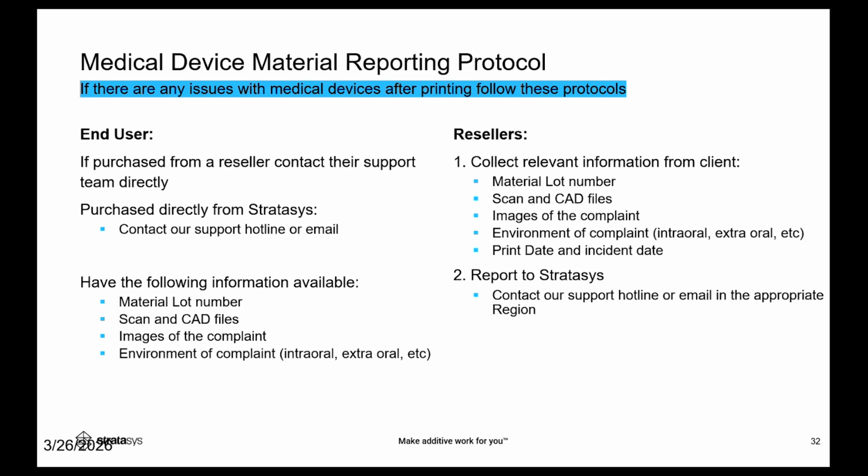That being said, we do need your material lot number if it's a material complaint. Your scan and CAD files are very helpful because we can diagnose them. We have dental technicians on the team, like Robert, who look at those designs and how everything relates to each other. Send images, and the environment of your complaint, whether it's an intraoral or extraoral issue, along with your print date and your incident date. If you give us those, we will be able to quickly diagnose it and give you tips and tricks, or figure out if it was a material issue.